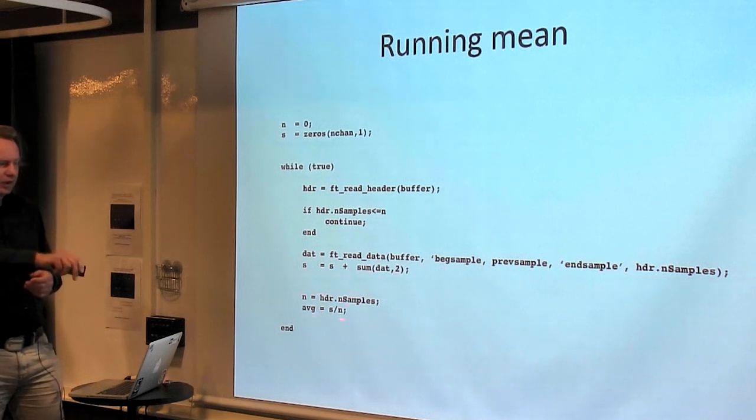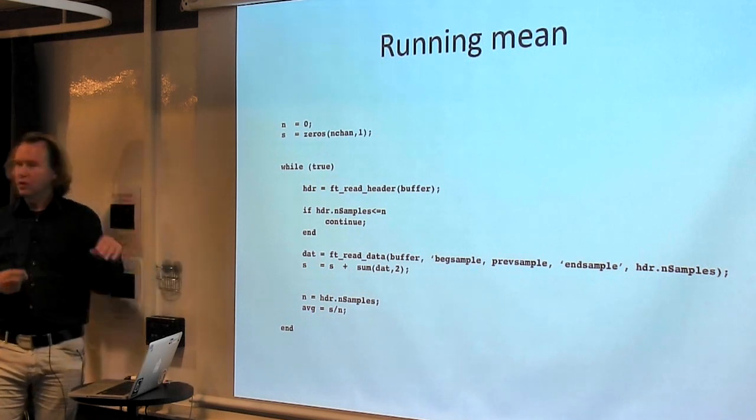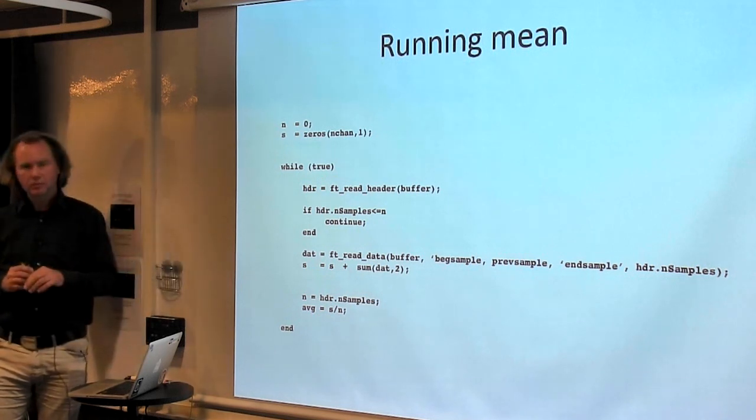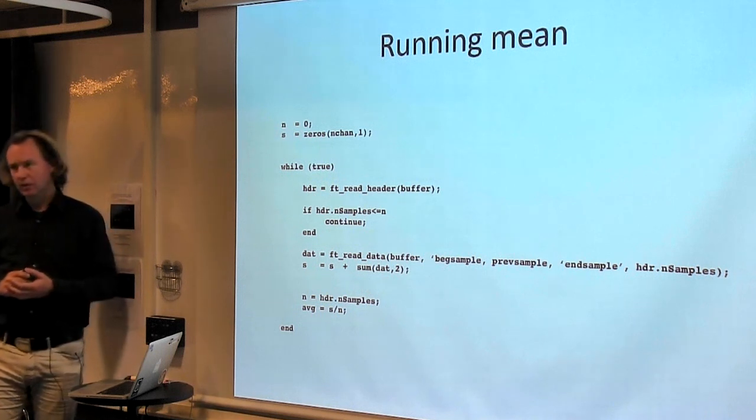Again I update n, and here I compute the average. So this is computing with constant time. So this can just keep running, and it's not going to slow down in any way.